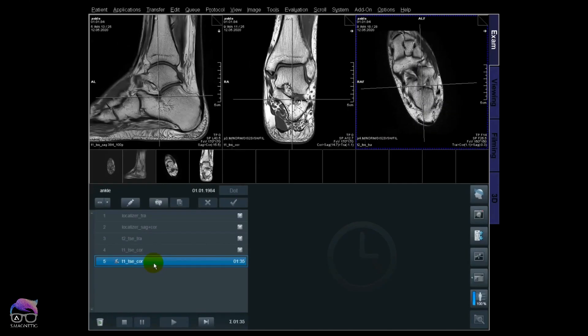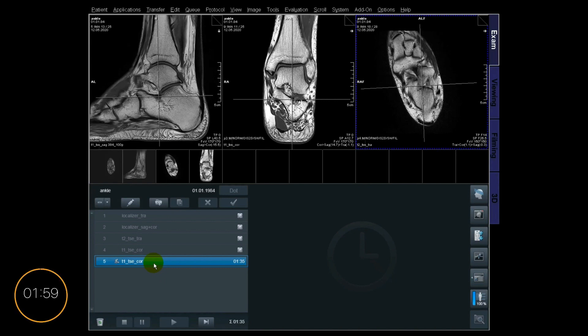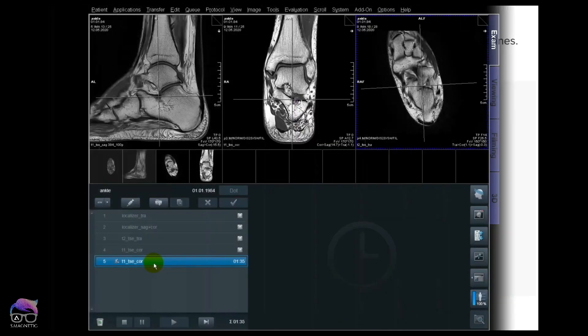All right guys, we are live at the 1.5T lab — but remember, this perpendicular tool works the same on 3T. Let the countdown of two minutes begin! Before we continue, I just want to show you what perpendicular means: two distinct lines intersecting each other at 90 degrees, or a right angle, are called perpendicular lines.